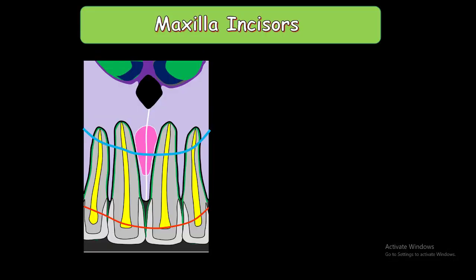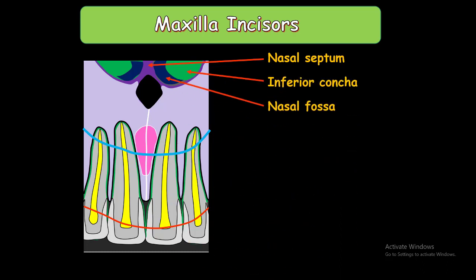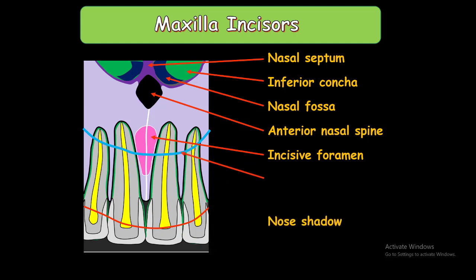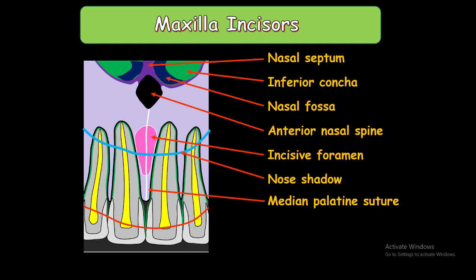The periapical radiograph of the maxillary incisors contains these parts: the nasal septum, the inferior concha, the nasal fossa, the anterior nasal spine, the incisive foramen, the nose shadow, the median palatine suture, and the lip shadow.